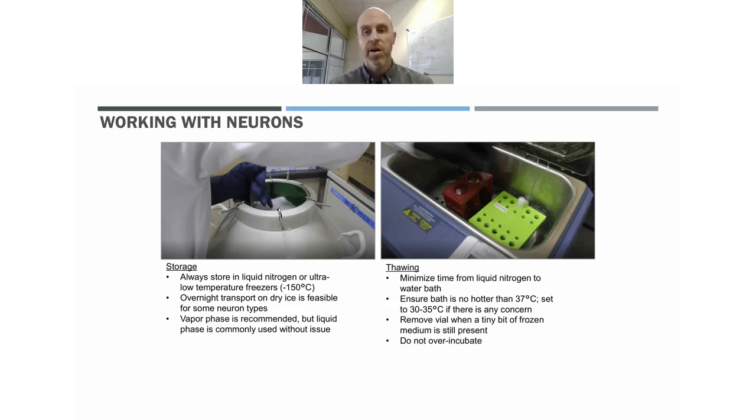So this cell type, or iPSC-derived material, always needs to be stored in ultra cold temperatures. You can't store them in a -80 freezer, and they're very heat sensitive. So it's better to thaw them in a water bath that's 35 degrees than a water bath that's 40 degrees. And to some extent, this is commonsensical, but also, again, differs from many other cell types that people maybe have worked with in the past, particularly cell lines.